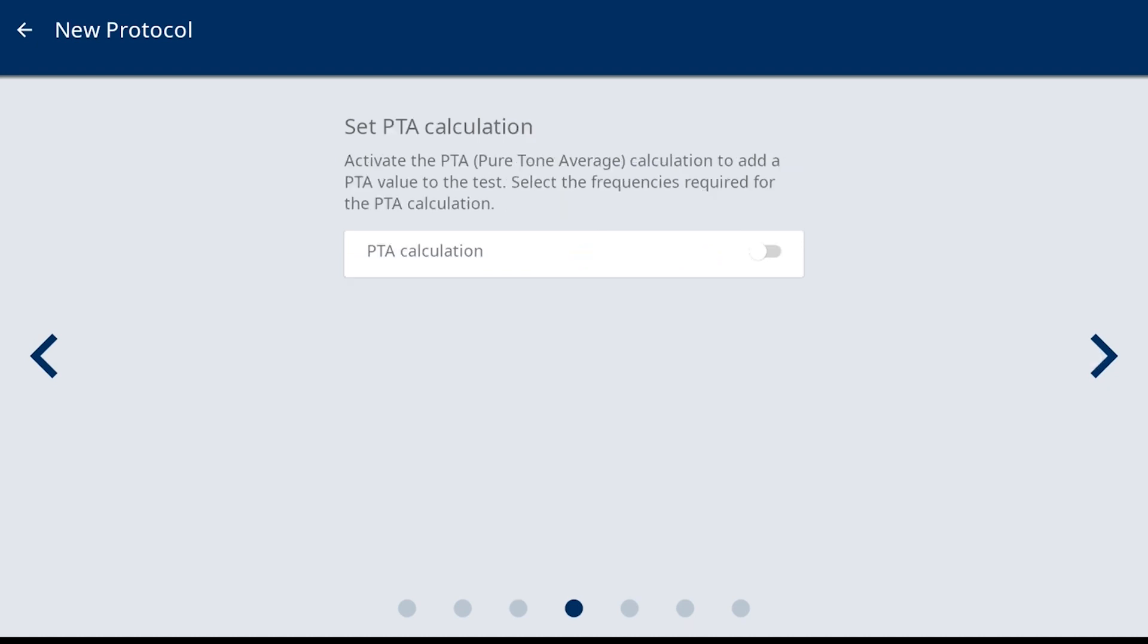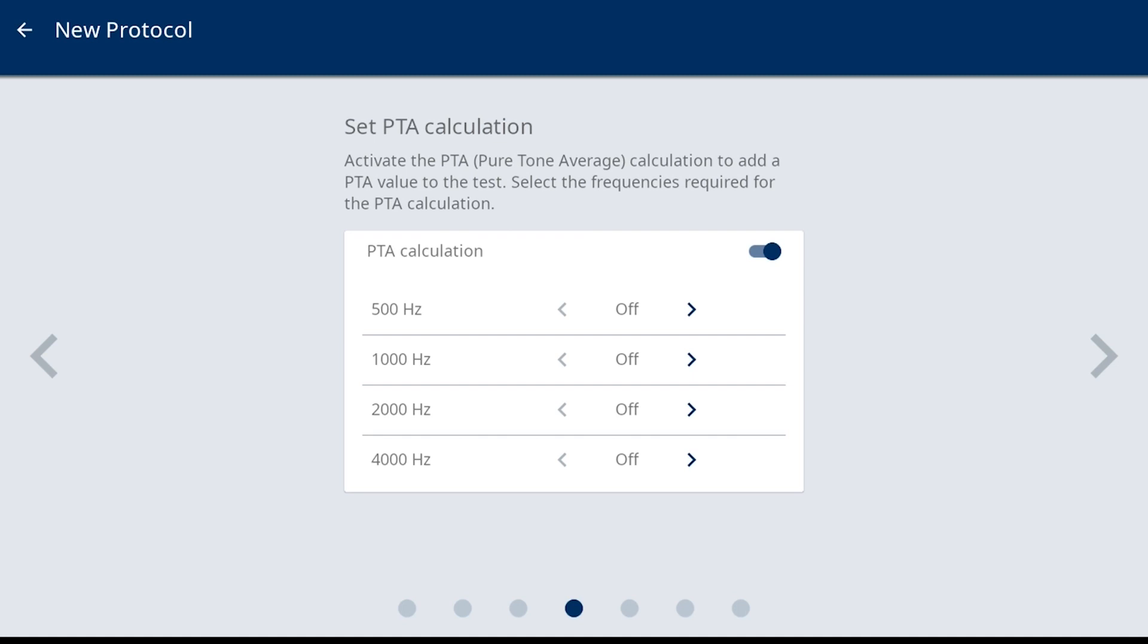Set Pure Tone Average Calculation is next. This is defaulted to off, but when preferred to have displayed, select the slider to turn on. When the setting is activated, the Pure Tone Average will display on the test screen and on reports. The frequencies that were selected for this protocol are listed and available to include them in the Pure Tone Average calculation. You can also weight a frequency more heavily than others by selecting x2.